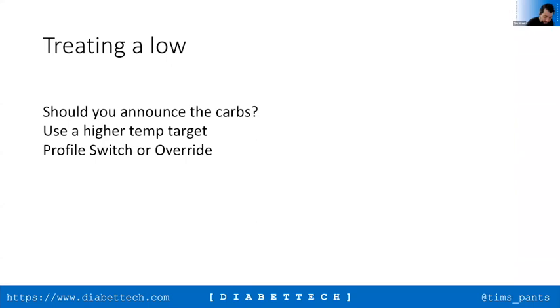Okay, because I have mine set at 8.5 because I don't think 6.5 for a post-hypo temp target is high enough. It doesn't give you enough room, especially as I find, and I know a lot of people find, that post-hypo, if you give insulin, you're actually more insulin sensitive, and therefore potentially 6.5 isn't enough of a difference to not suffer from repeat hypos. 8.5 feels very strange for me because it's way outside my normal range.